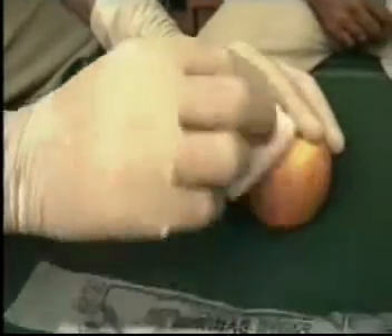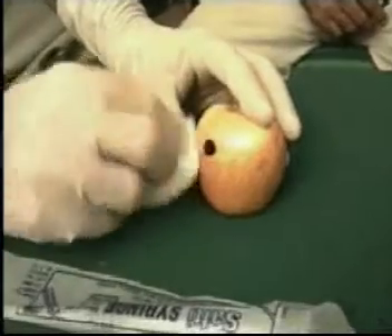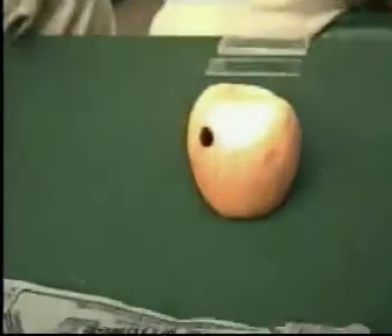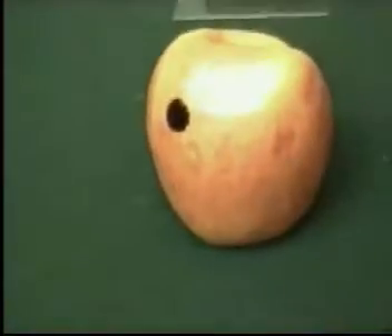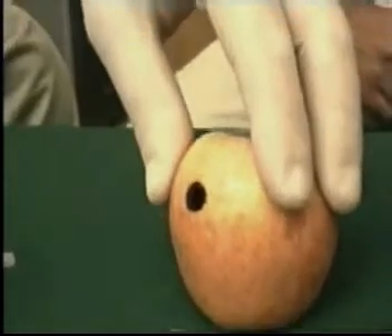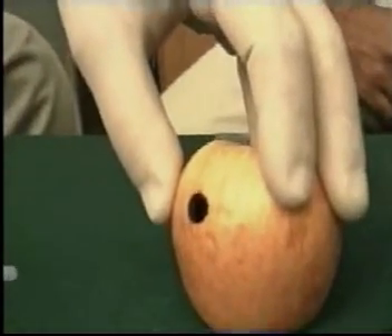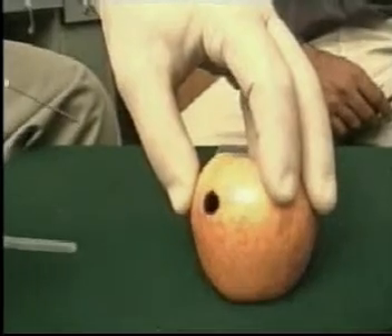The first step is that the operator should be wearing sterilized gloves, and with the spirit swab clean the area where you are supposed to perform the fine needle aspiration cytology. Once it's been cleaned, you can take up the syringe, remove the cap, and hold the growth or the organ in which you are supposed to do the FNAC with your left hand.